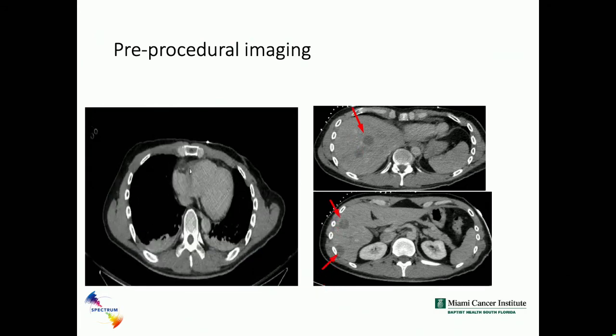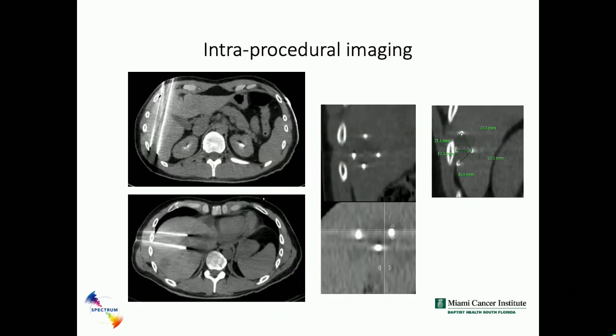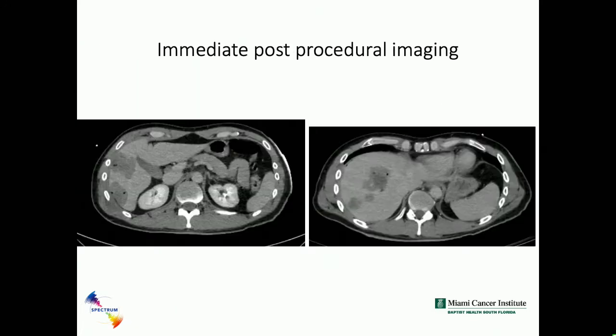So next one. Those were the 3 that were targeted for the treatment. Next slide. So here are the needle placements and the 3D reconstructions. We used 4 needles for 2 of those and 3 in 1. Next slide, please. And so this was the immediate post-procedure.